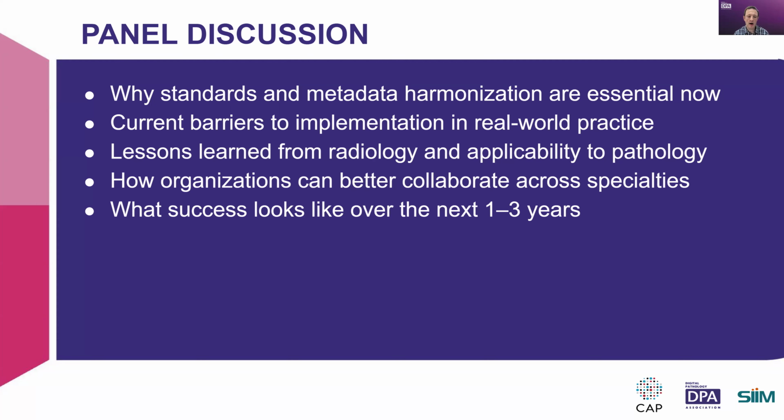It's a great question. One of the things that's been a barrier in the past, or a lesson learned for us, that may be less of an issue into the future, is the utility of some of the DICOM fields. For us, some of the really key fields that help the humans identify studies are things like procedure description and series description. And in informatics language, those fields are garbage. They're all free text.